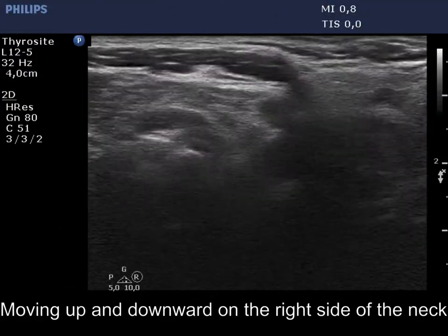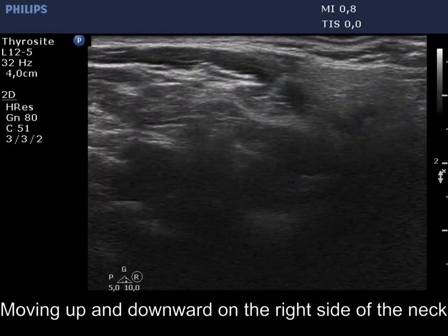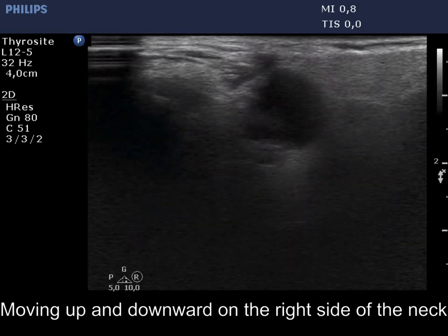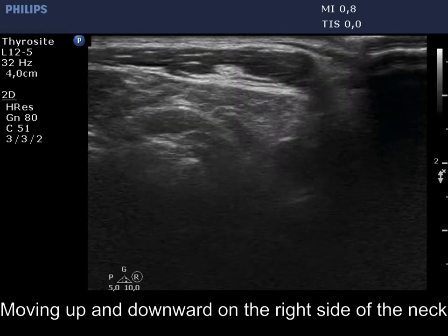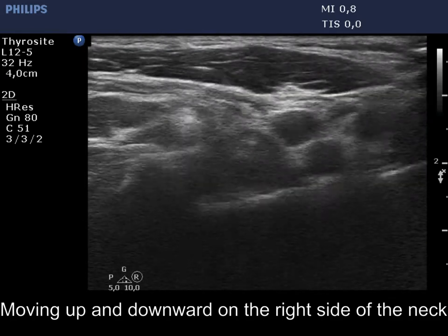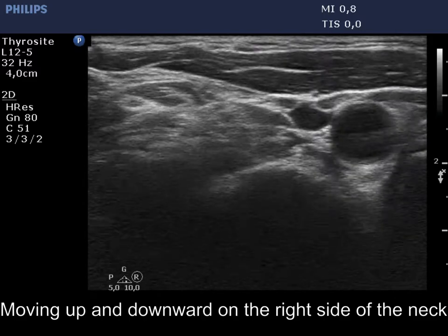Now we move with the transducer up and downward. The thyroid is marked with a yellow arrow.